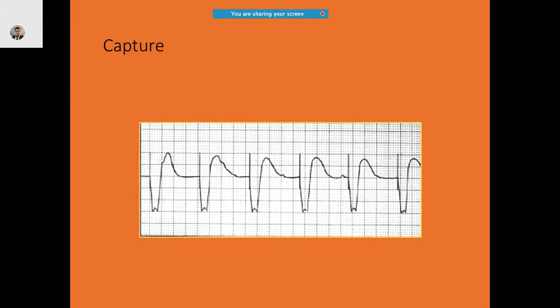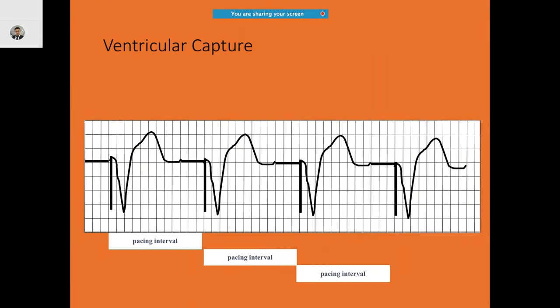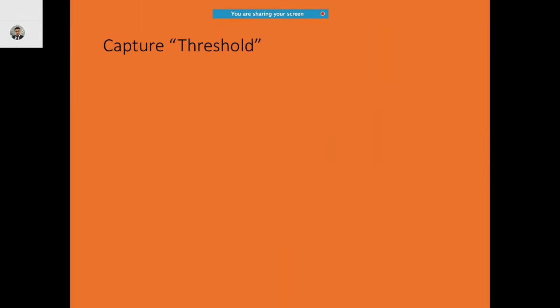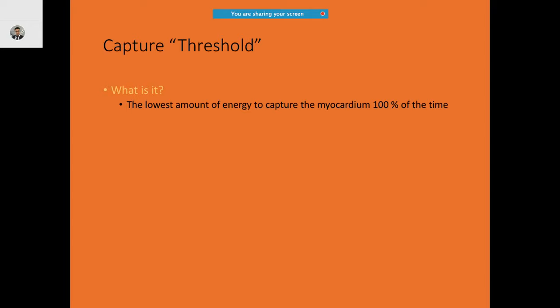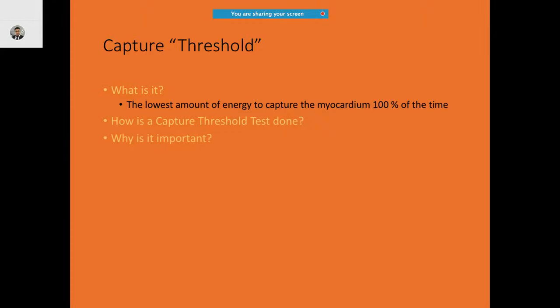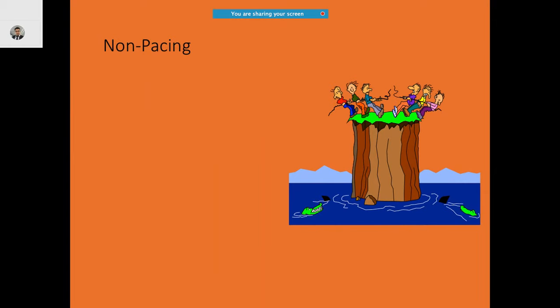In ventricular capture, this is most likely a single-chamber pacemaker only in the ventricle — you see the pacing intervals are regular. Capture threshold is the lowest amount of energy delivered to capture the myocardium 100% of the time. A lot of times you will see there is no pacing — the reason is either loss of capture or loss of output.